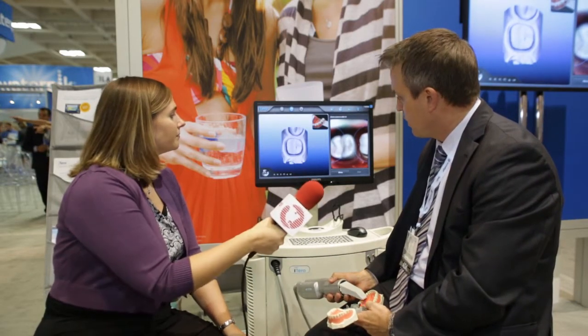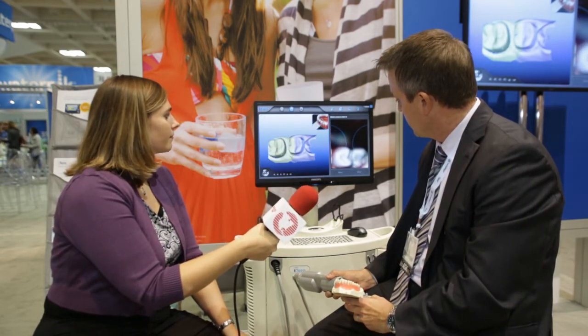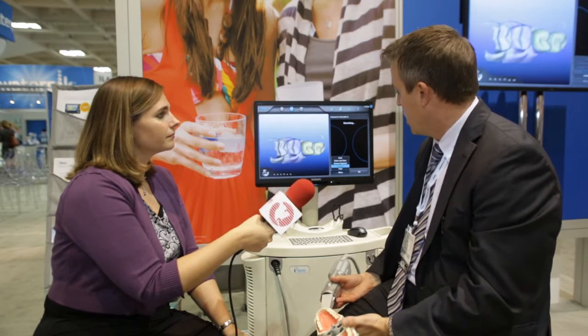So I've scanned the prep. Now I'm going to scan the contacts of the adjacent teeth. What are some of the advantages to having this in the practice? Well, you're getting a more accurate impression because you're not using impression material, and all the variables that come with impression material. So you're getting a more accurately fitting restoration that fits every time. It eliminates remakes and retakes of impressions, and you have a shorter seating time as well with limited adjustments to the restorations.